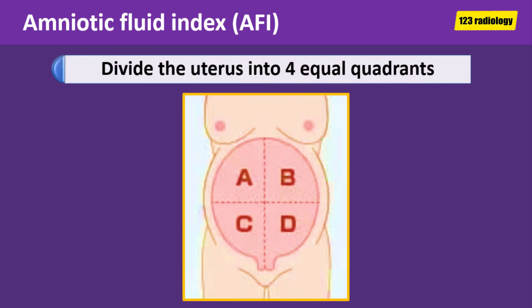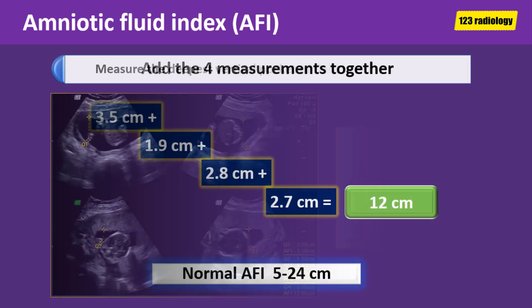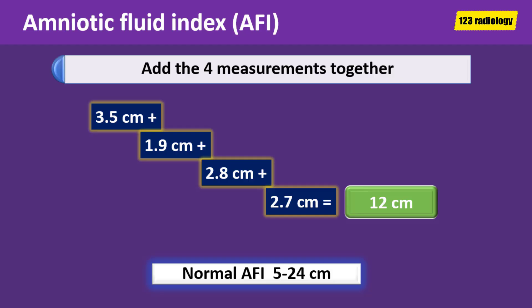The first step in measuring amniotic fluid index is to divide the uterus into 4 equal quadrants using two lines: a transverse line passing through the umbilicus and a vertical line passing through the linea nigra. Step 2: measure the deepest vertical pocket of fluid in each quadrant with the ultrasound transducer perpendicular to the floor. Amniotic fluid pockets should be free of cord and fetal parts and measurements should be in centimeters. The last step is to add the 4 measurements together — their sum is the amniotic fluid index.